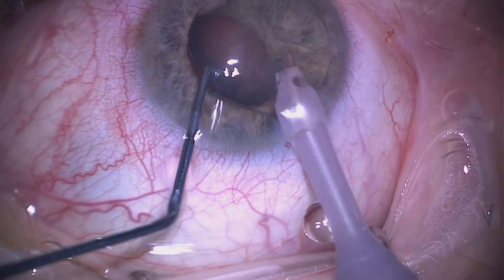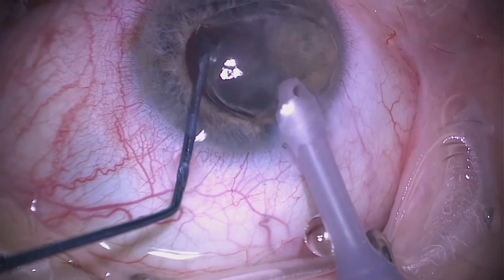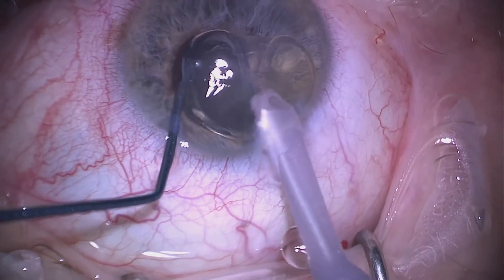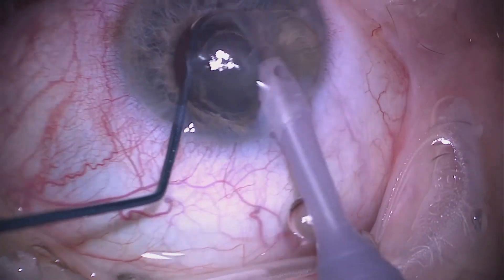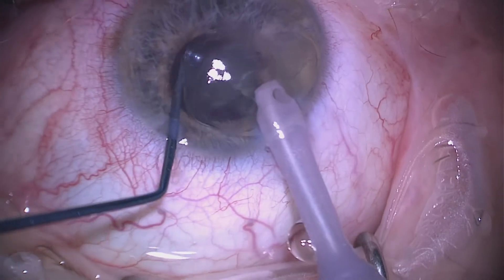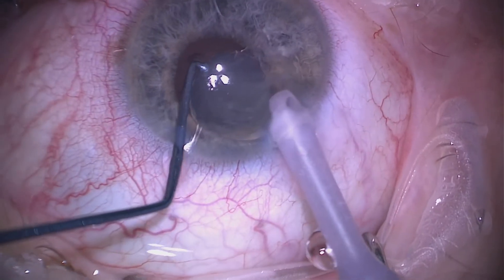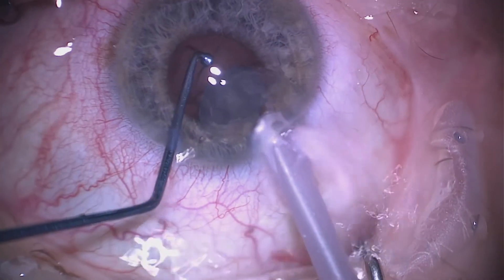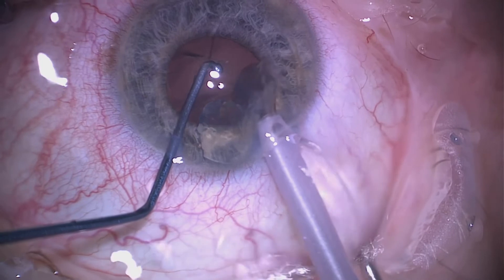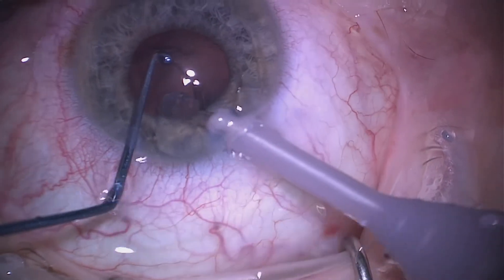Very gently, we phaco-aspirate the lens from within the capsular bag, keeping everything very gentle with low flow settings. The aim here is to aspirate this clear crystalline lens into the phaco probe without causing any disturbance to the anterior hyaloid face, as we do not want vitreous prolapsing into the anterior segment and ending up in the tip of the phaco probe.